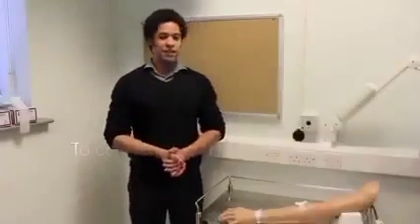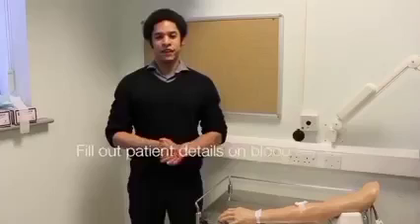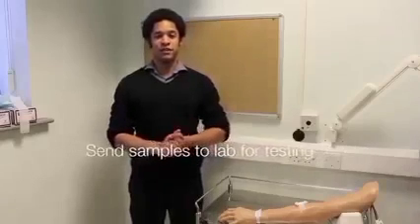Thanks for letting me take your blood. To complete the procedure, fill out the patient details on the vacutainer bottle and make sure the blood sample is sent off to the labs for testing.